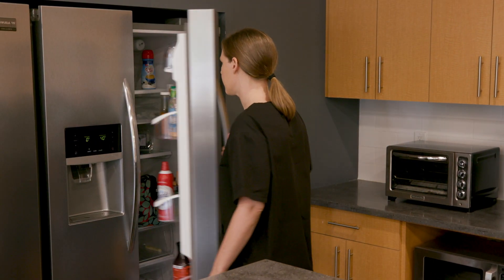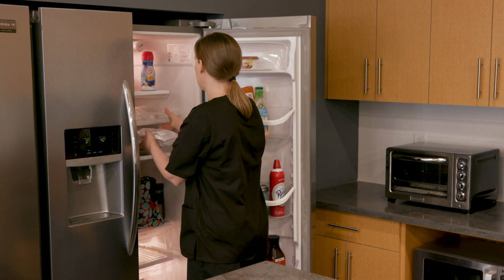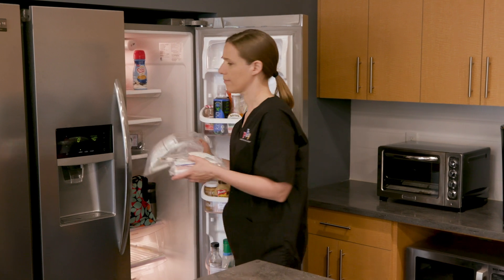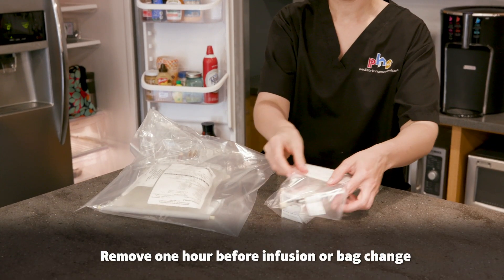Remove the home parenteral nutrition or HPN bag and any vitamins or medicines sent by the pharmacy from the refrigerator one hour before the infusion or bag change is due.